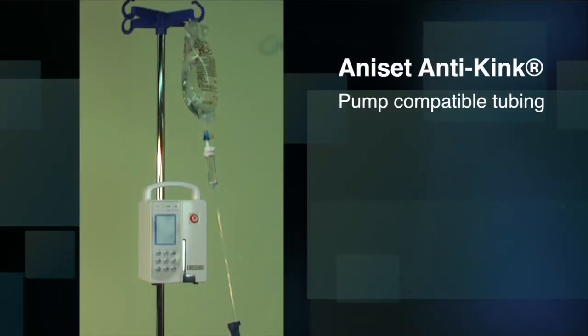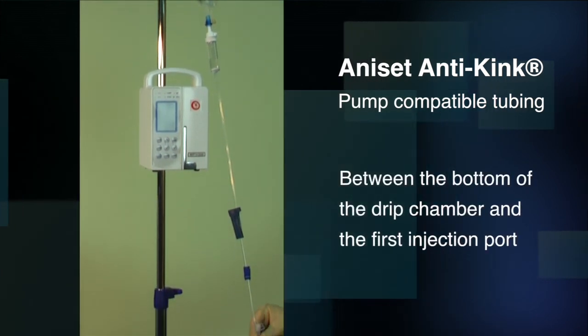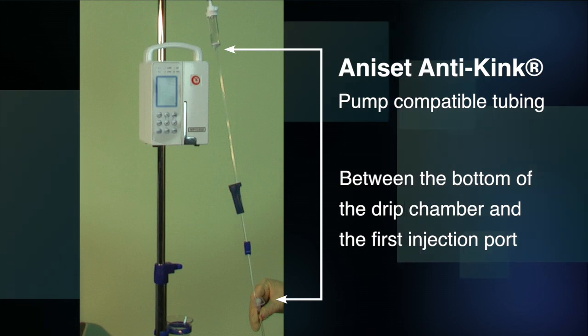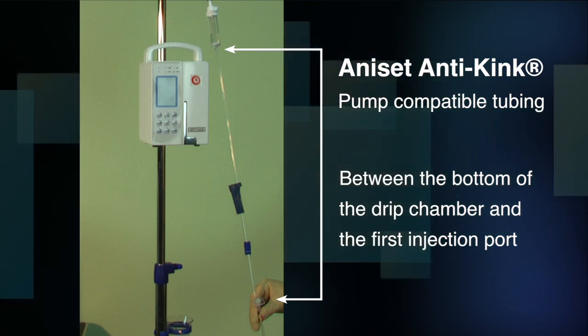The AniSet anti-kink pump compatible tubing is the section of tubing between the bottom of the drip chamber and the first injection port. This is the only section of tubing that must be placed within the IV pump. It's both suitable for vertical and horizontal placement.